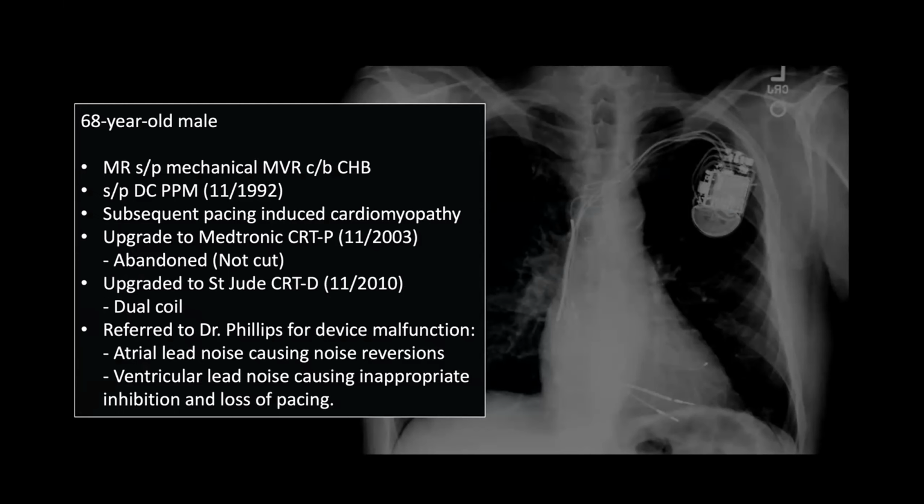The SVC, and that was one of our biggest concerns. This doesn't look good. If we are going to pass a laser sheath or a tight rail or a mechanical extraction tool here, there's a very high chance of causing a tear, and that's a whole disaster in itself.